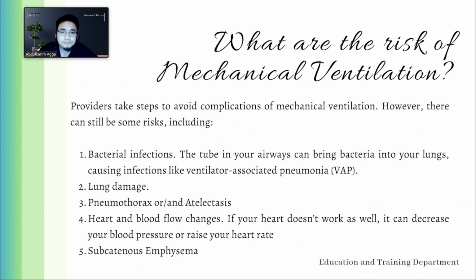So what are the risks of mechanical ventilation, or basically some of the complications that you need to remember? Number one, you have your bacterial infections. The tube in your airways can bring bacteria into the lungs, causing infections like ventilator-associated pneumonia. Again, you need to remember ventilator-associated pneumonia.